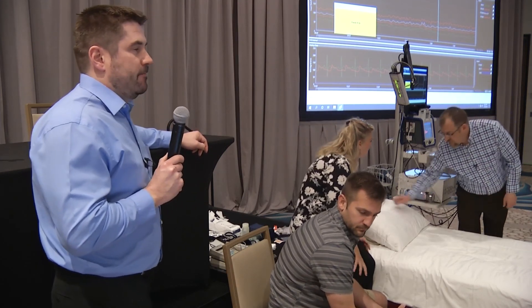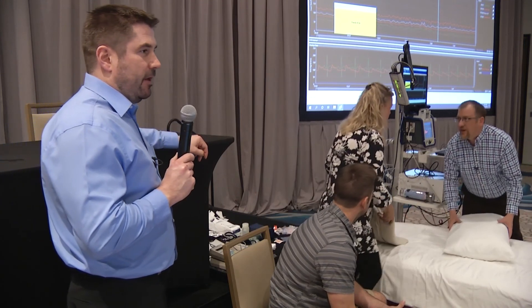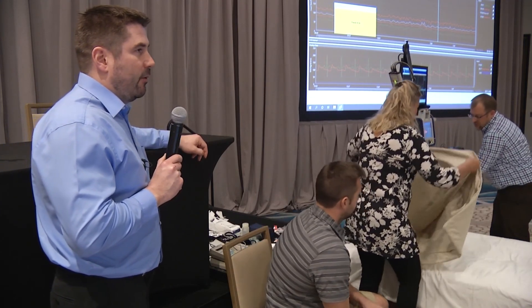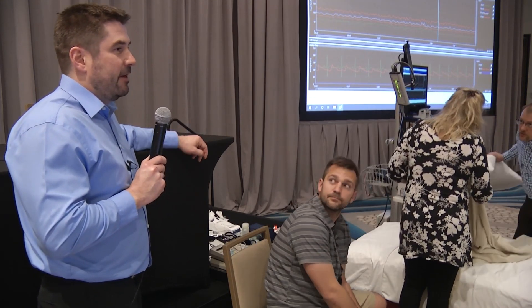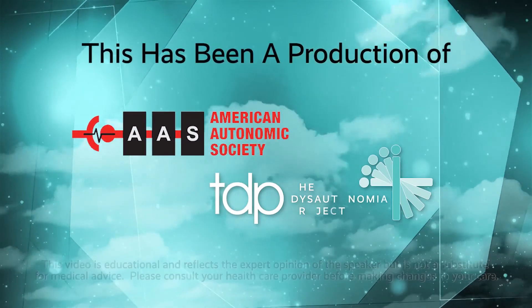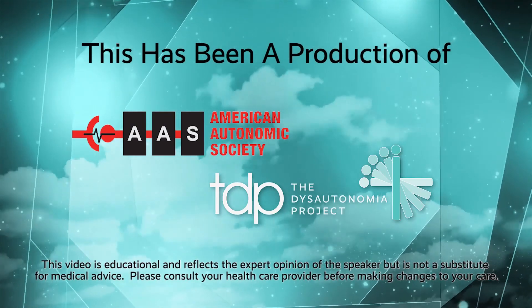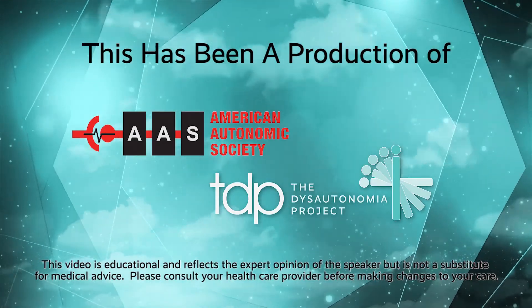For interpreting the different phases, we heavily rely on the mean blood pressure. However, pressure recovery time was defined and normative values were derived using systolic blood pressure.